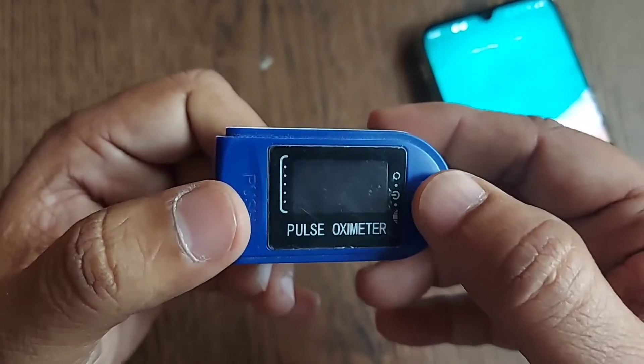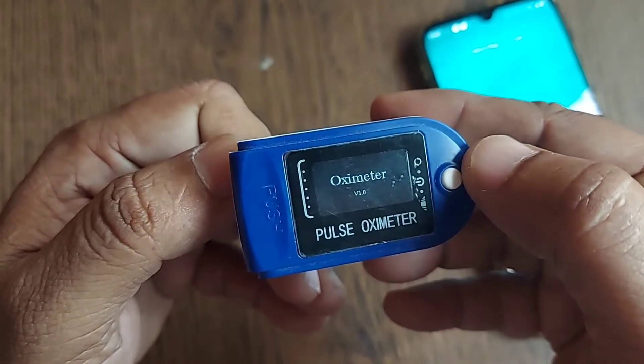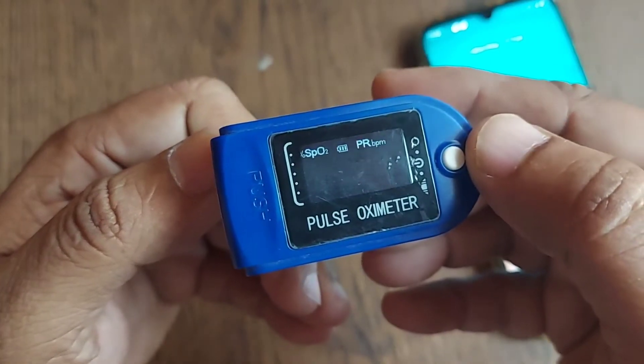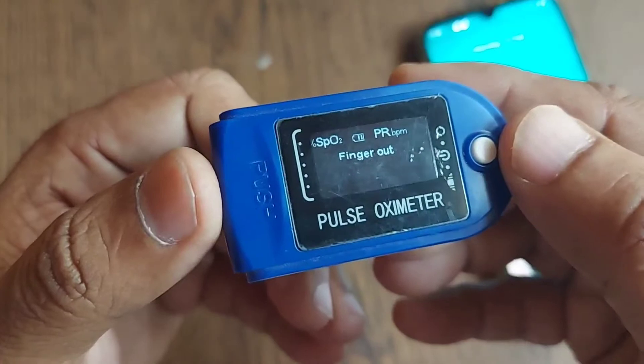I am just switching on the power to show you what exactly it displays. This device is now switched on. The power mode is switched on, and it is showing 'finger is out.'